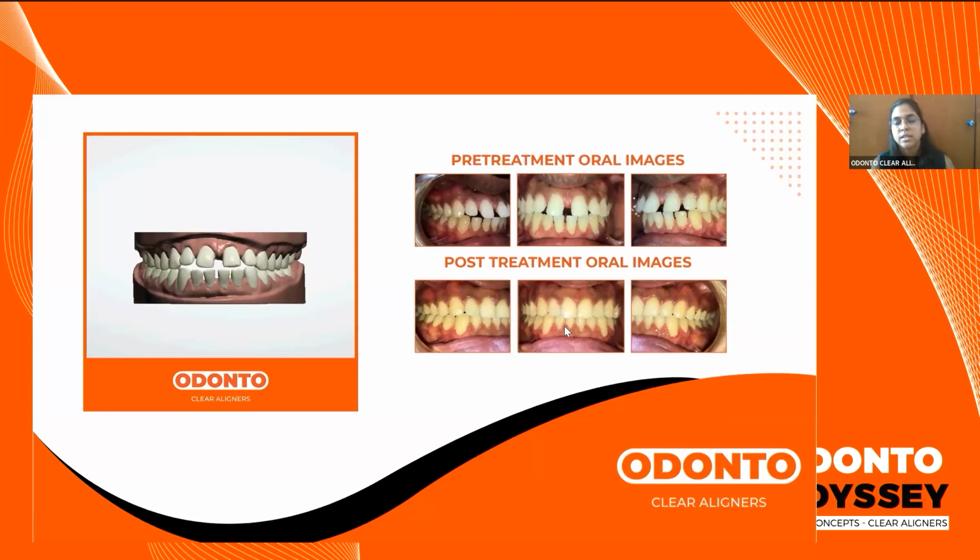Up to 5 degrees is considered a mild rotation and can be corrected very easily with the help of attachments. If it is 10 degrees or so, we might require auxiliaries to come into the picture. Now, auxiliaries means there will be an attachment on the tooth, as well as you might have to bond a button. All these will be provided to you. You might have to bond a button, run a few elastics, either buccally or lingually, and this will allow for correction of it.